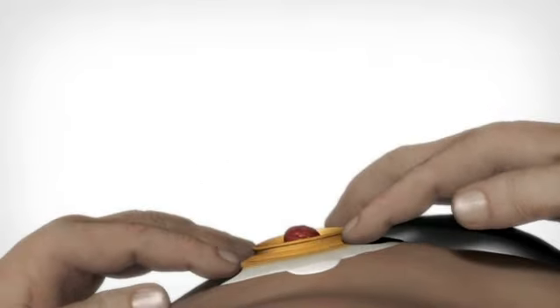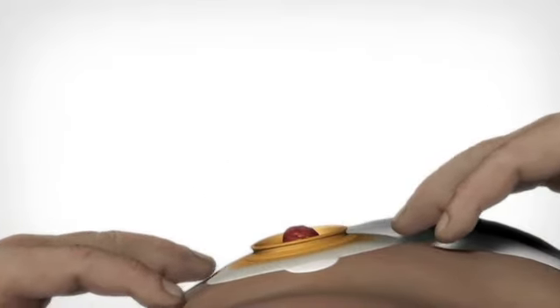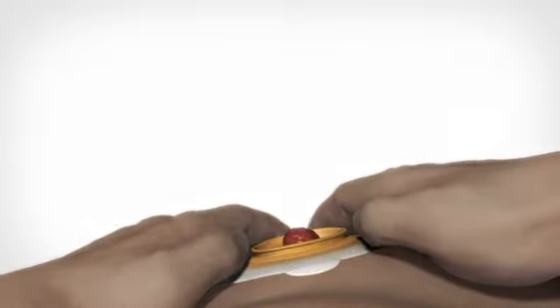Smooth the adhesive down from the stoma out to the edge to ensure that the adhesive has body temperature and has full contact with the skin.